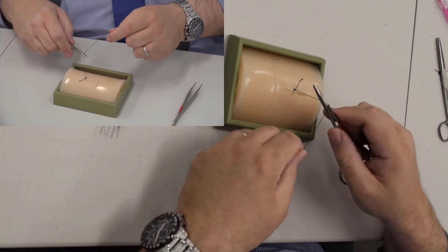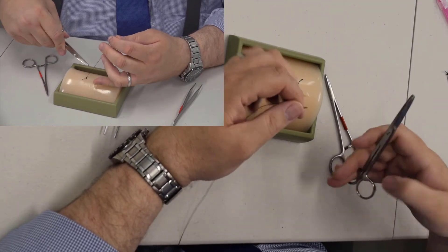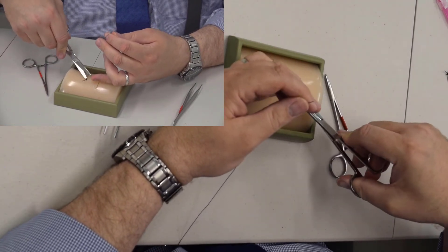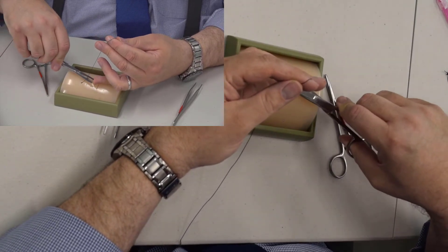Silk requires three knots to make sure it doesn't come undone. Vicryl, which is an absorbable suture, will require about seven.